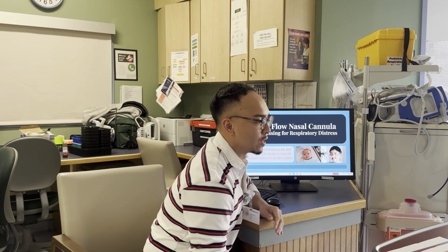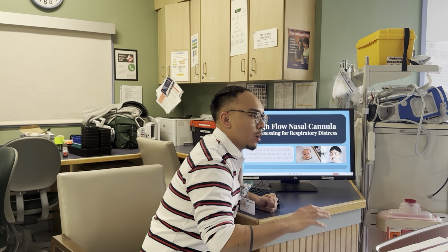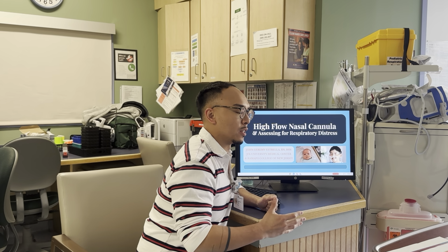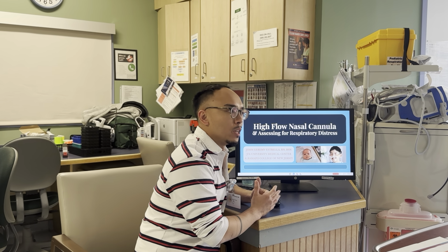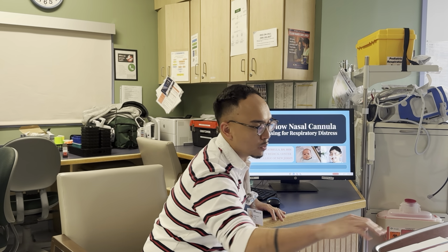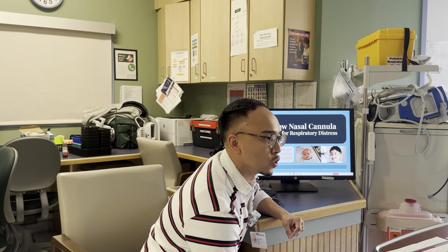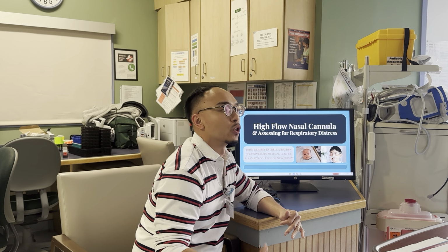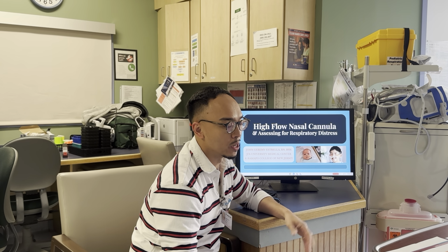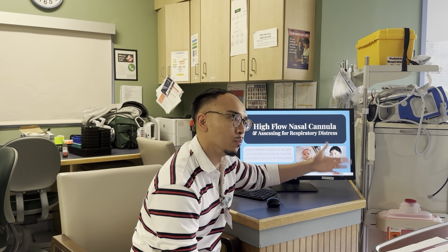What we're going to go over today primarily is our high flow nasal cannula flow chart algorithm, which was provided by Dr. Kaur. It's basically a way for us to assess eligibility and criteria for admitting patients to start high flow nasal cannula here on the floor. We're going to be using this respiratory severity score to help us determine this eligibility, and if we have the capacity to take care of this patient, and if they present with the symptoms that says they're allowed to be here or if they need to be transferred out.